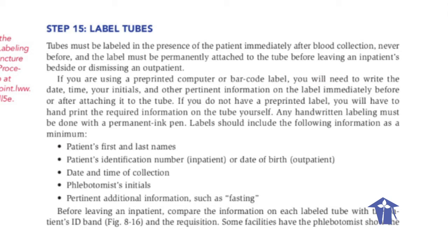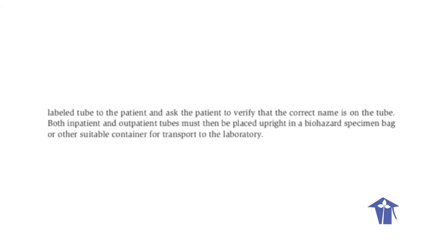Before leaving an inpatient, compare the information on each labeled tube with the patient's ID band and requisition. Some facilities have the phlebotomist show the labeled tube to the patient and ask the patient to verify that the correct name is on the tube. Both inpatient and outpatient tubes must then be placed upright in a biohazard specimen bag or other suitable container for transport to the laboratory.